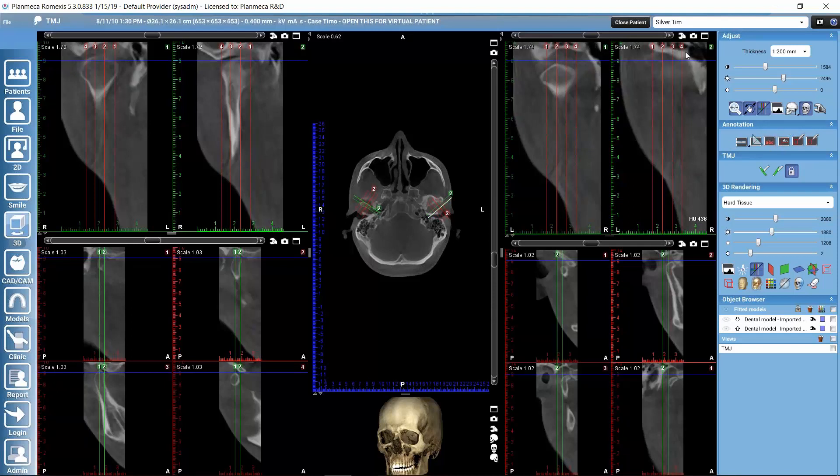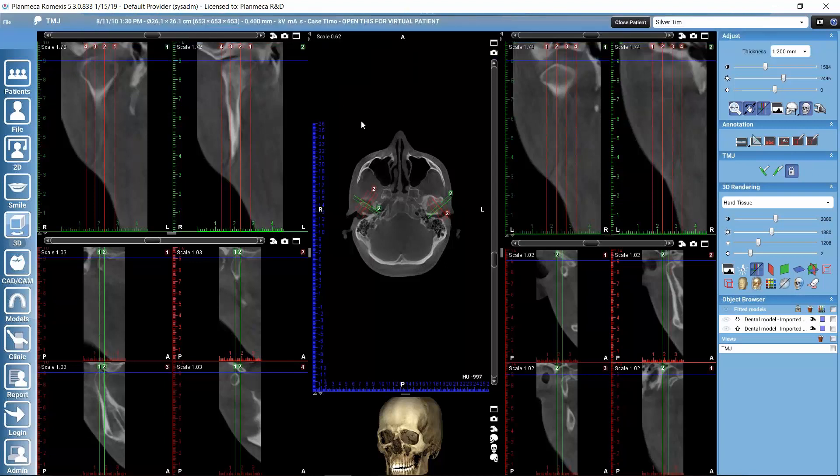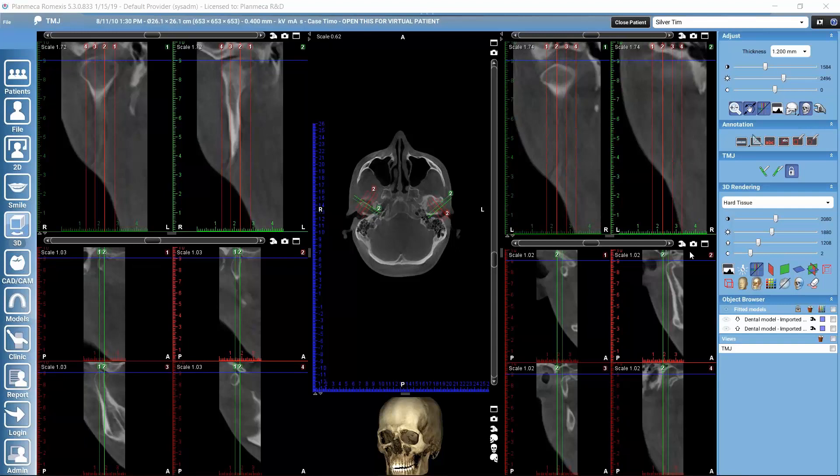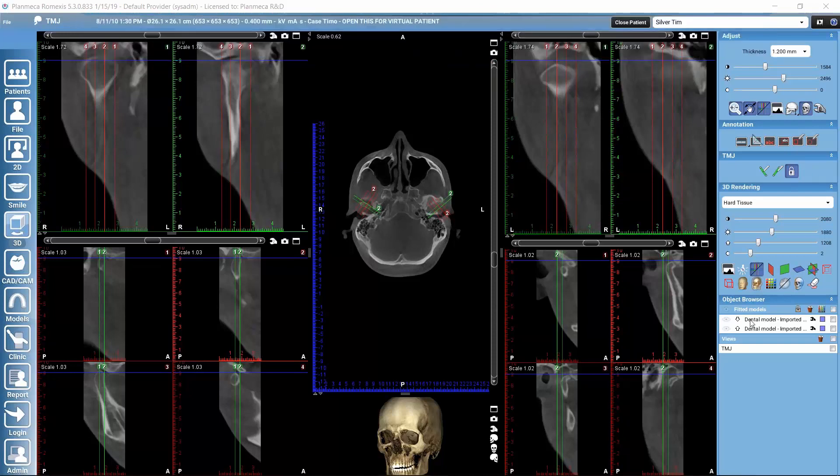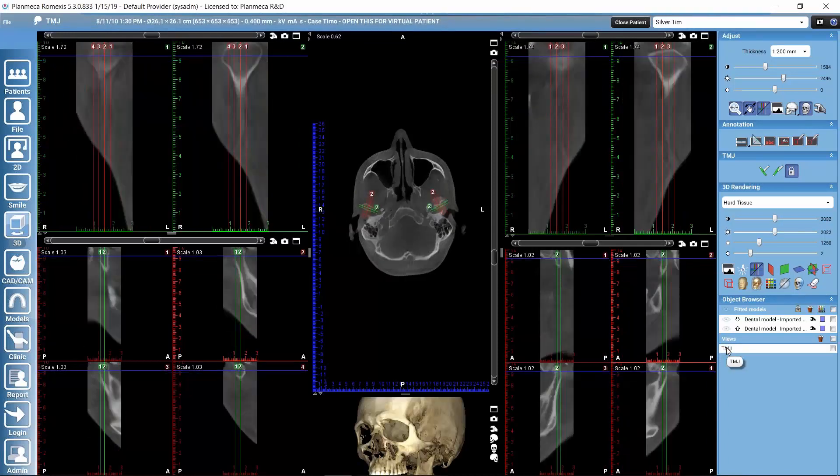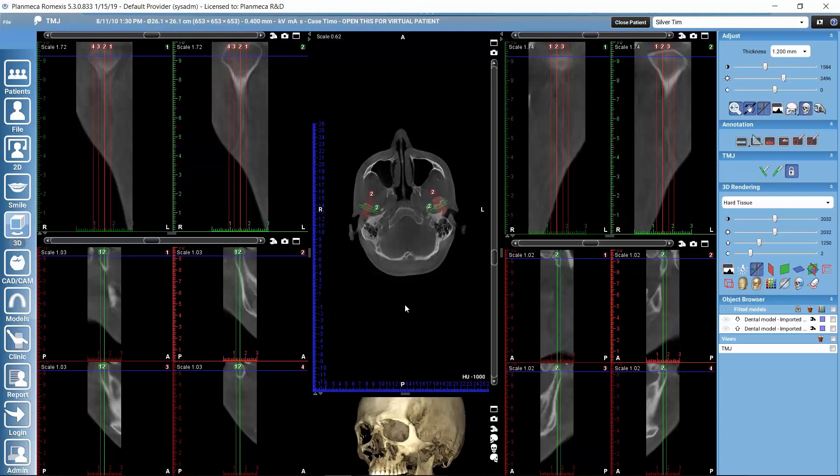Then normally, just like always, we could use this snapshot icon to take a 2D snapshot of each view. That is automatically saved here in the 2D imaging module for the patient. Or then, if we would like to get a 2D view or 2D image of all the views at the same time, we could use this save 2D view in order to sort of record our findings and our annotations in 2D format. Or naturally, we could also save a view. We could use this save view button and get this kind of link here that we can click, and that brings us automatically to the view that we had saved. So if we want to go back to some specific view that we had defined here the next time when we open this patient.